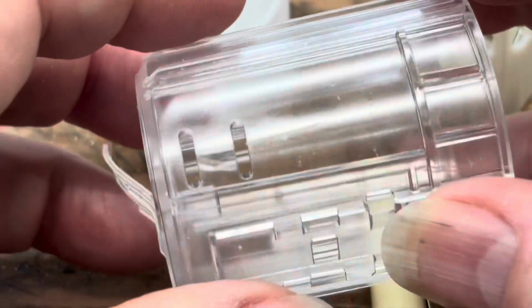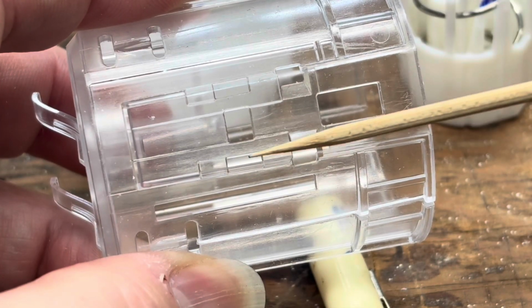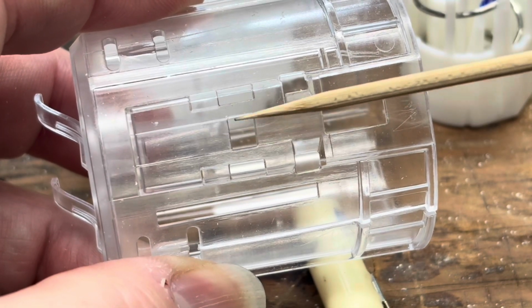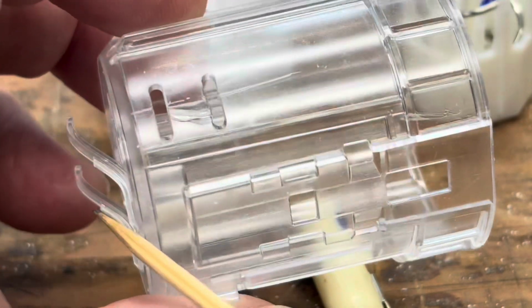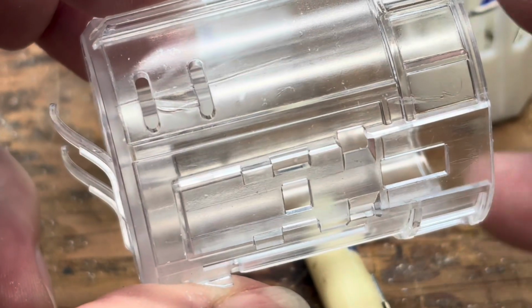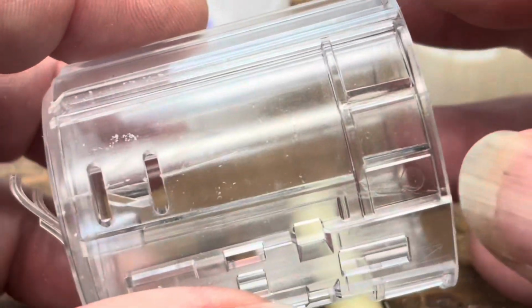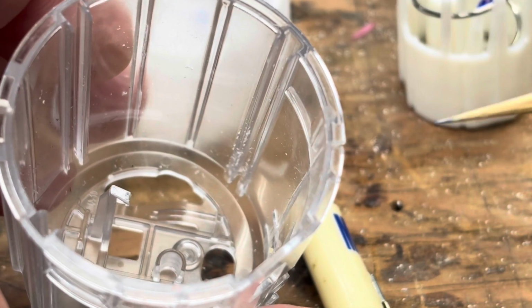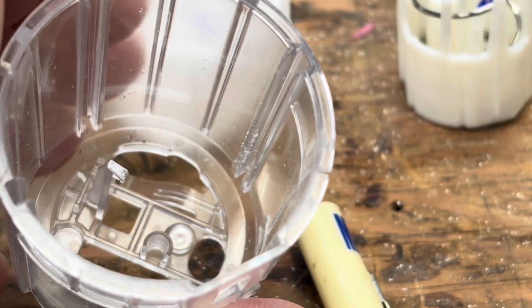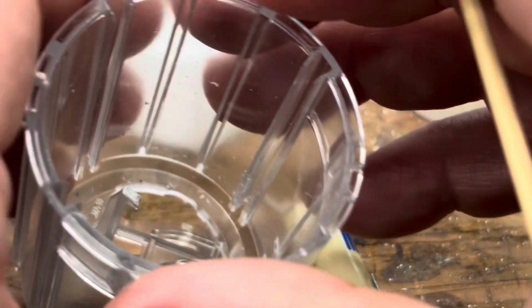This is cup 2. Primary functions I know of here. These are the slots that the trigger mechanism locks into. Down here is armed. Up here is don't come apart. Also notice the 2 plastic springs down here that push against cup 1 so that the button doesn't do anything until the patient compresses this against their arm. And down here is the hook in cup 2 that reaches through cup 3 and hooks on cup 4 at a key moment. I'll explain more about how that works later.